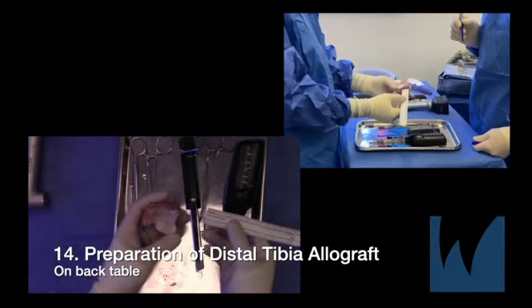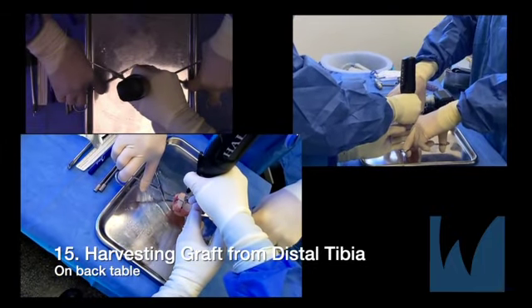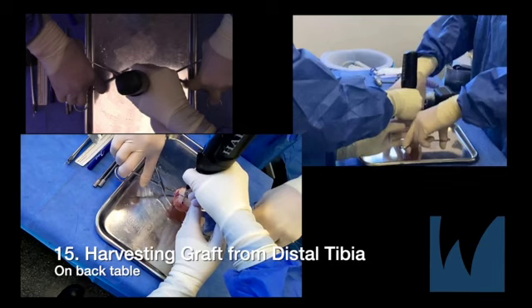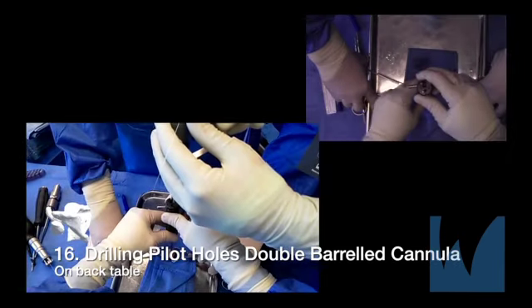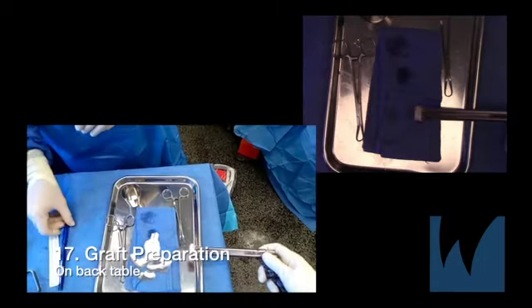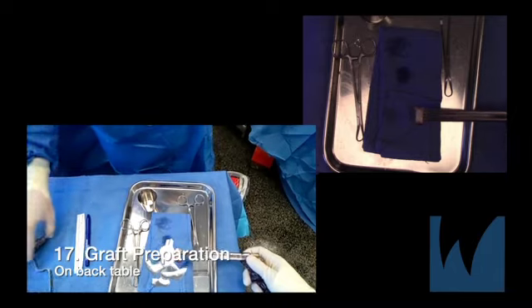The distal tibia allograft is first outlined to be cut 1 by 2 by 1.5 centimeters. The distal tibia allograft is seen being harvested from the cadaver bone. 2 holes are cut for mounting of the double-barreled cannula. Using the 3D model with HoloLens allows for better orientation for graft placement.